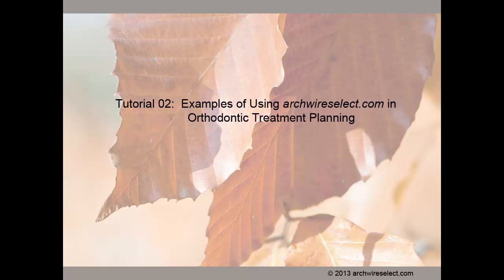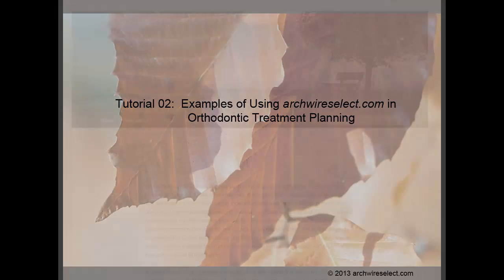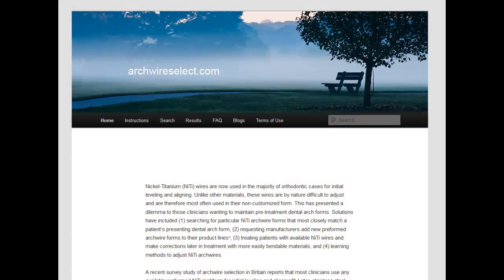In this second tutorial, we will describe how to enter dental arch form measurements and then search the stored catalog for those arch wires that most closely match them. Think of this application as simply a single catalog listing most of the world's orthodontic preformed arch wire vendors.